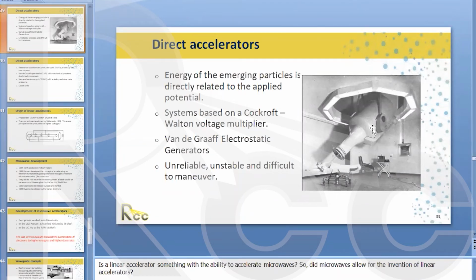Now, the output from a Cobalt unit is usually less than 100 centigray per minute. With the linear accelerator, you have easily over 400 centigray per minute, 500 centigray, even 600 centigray per minute, very common in a linear accelerator. Cobalt, with a fresh source, could be 100 centigray per minute, even 80 centigray per minute, depending upon the strength of the source. Usually these are 10,000 Curie sources that go in.